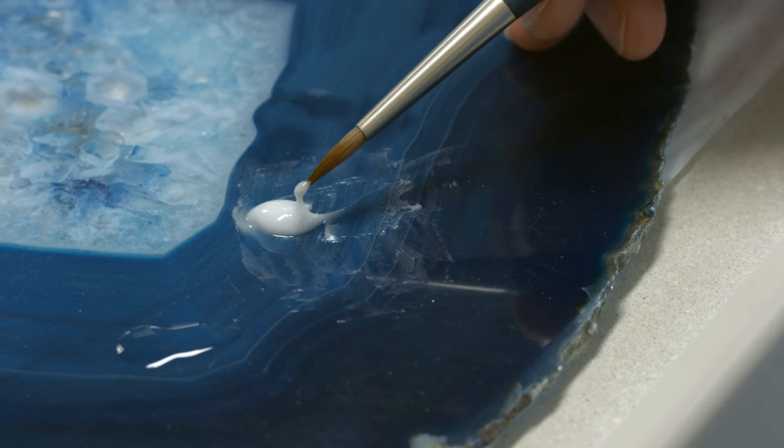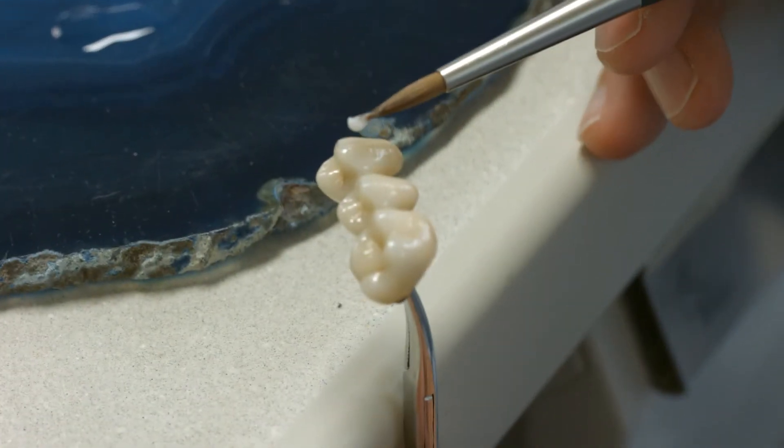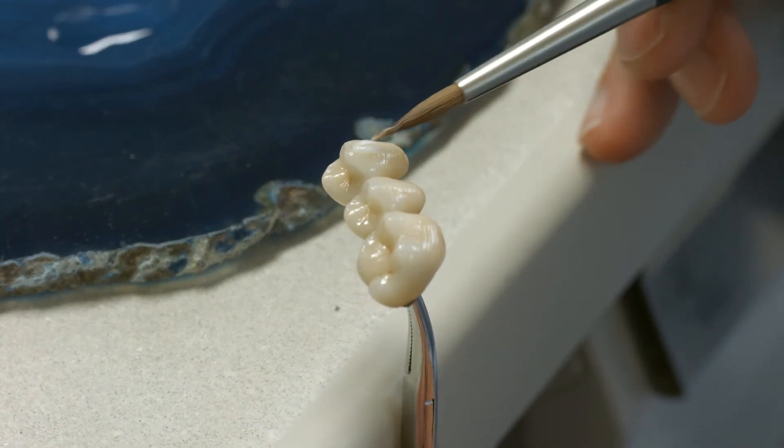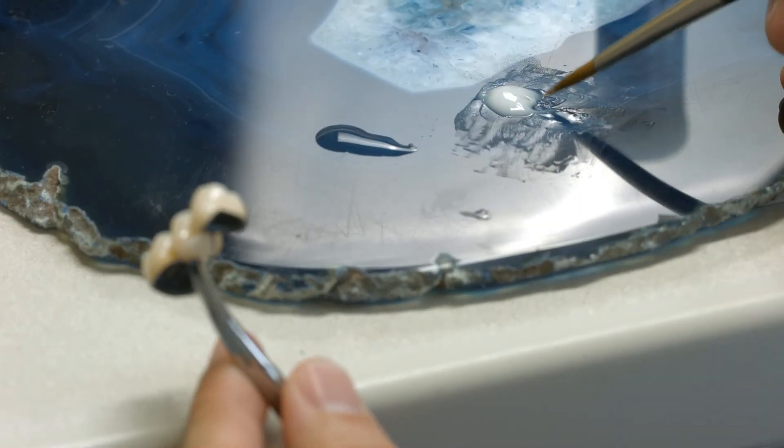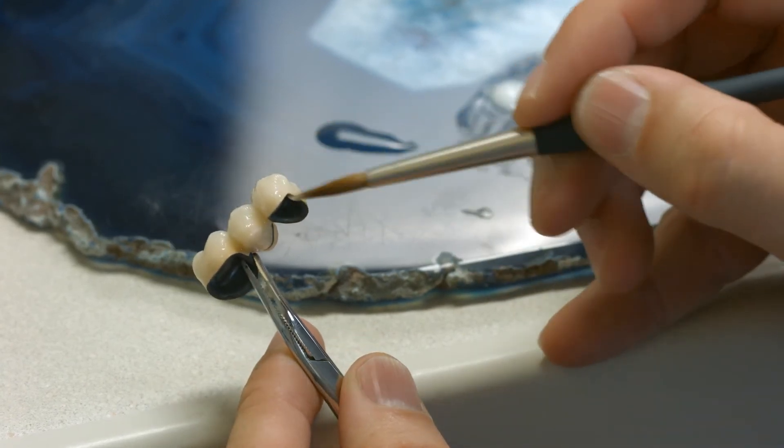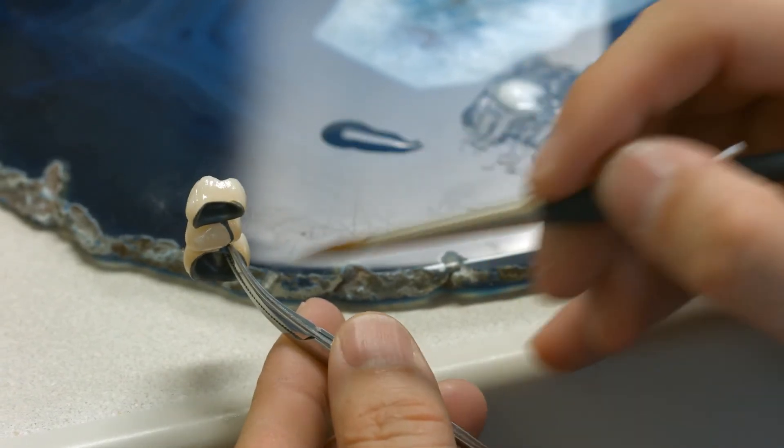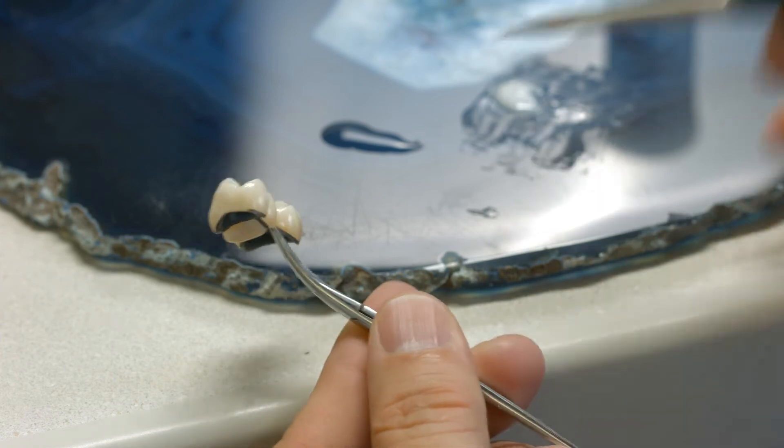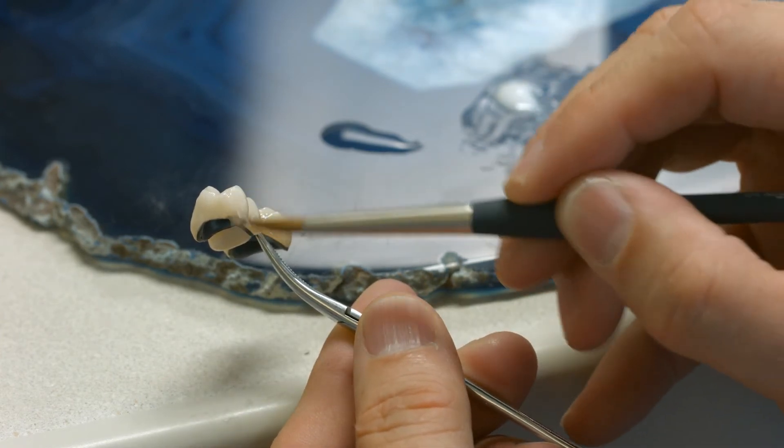Next, apply a generous layer of the glaze with a brush. For a high gloss finish of the restoration, apply a thick glaze layer. The degree of gloss of the glaze surface depends on the consistency and the amount of the applied glaze and not on the firing temperature.